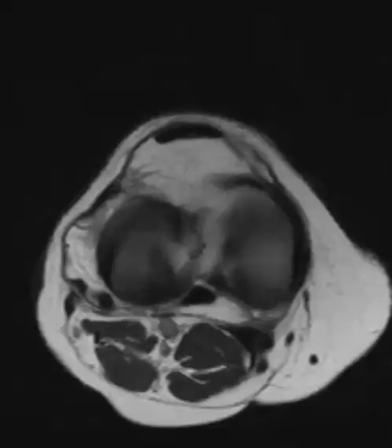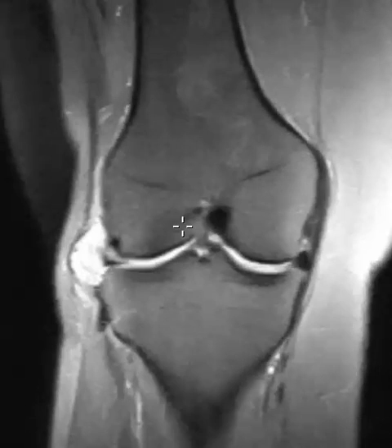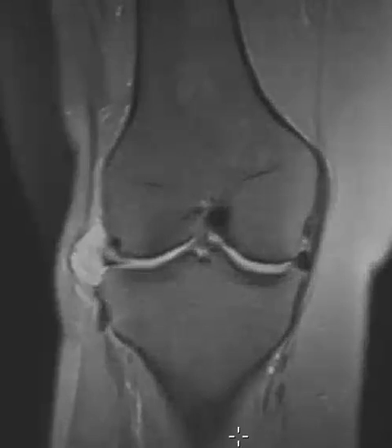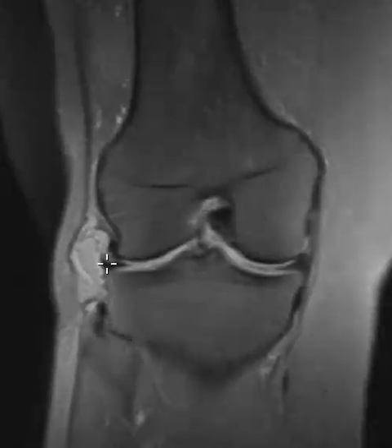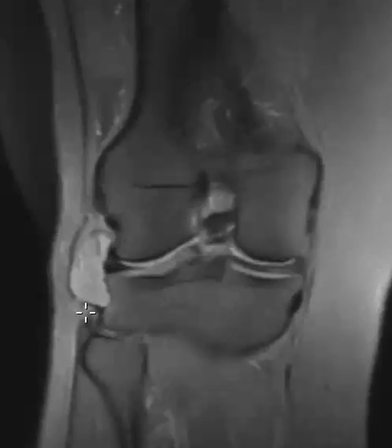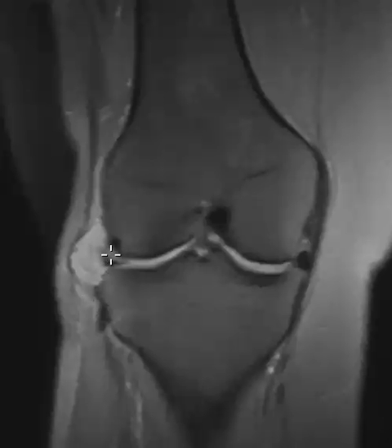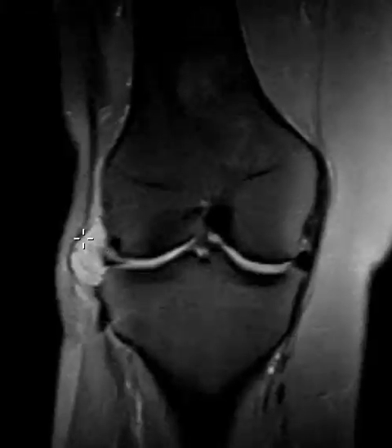On the coronal PD fat sat sequence, we can see the cyst as well. Now, we know this is a big lateral parameniscal cyst. However, there is also increased signal within the substance of the meniscus — the meniscus body and anterior horn show a horizontal band of signal that extends through the peripheral, middle, and inner thirds. It clearly contacts the capsular surface and fills up the parameniscal cyst.